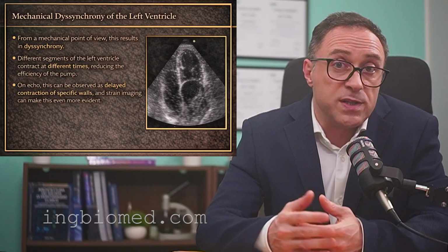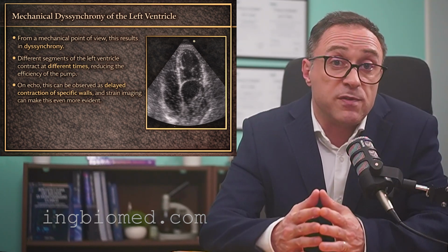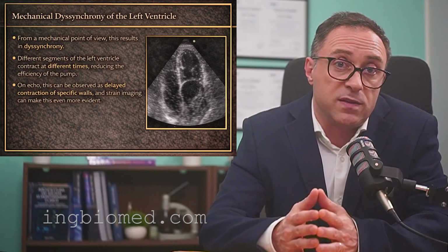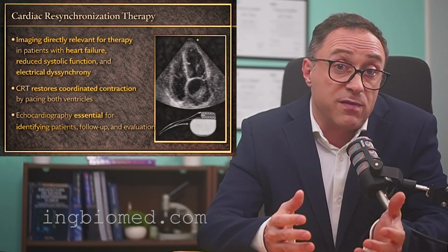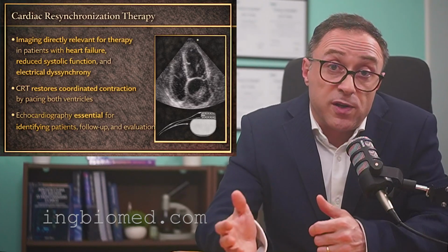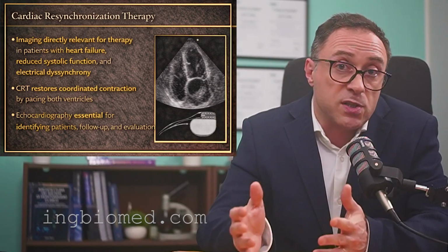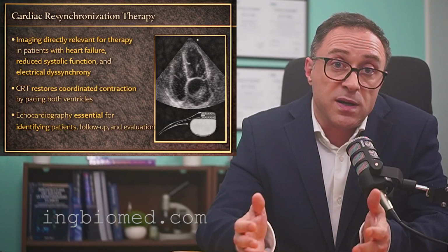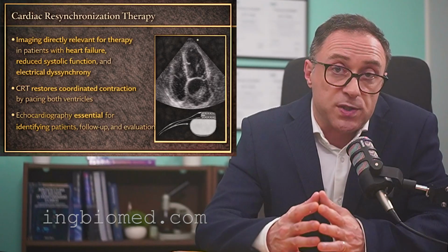On echo, this can be observed as a delayed contraction of specific walls, and strain imaging can make this even more evident. This is where imaging becomes directly relevant for therapy. In patients with heart failure, reduced systolic function and electrical dyssynchrony, cardiac resynchronization therapy can be considered.